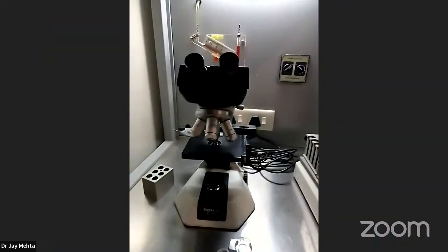So friends, actually, I am sitting inside my small IUI laboratory. And one of the most important words which you should keep in mind here is small. Even if you have a restriction for space, the laminar airflow which is going to suffice for an IUI laboratory will be either a 2 feet by 2 feet one or a 4 feet by 2 feet one. You don't need a laminar airflow higher than that. That is just one thing which you need to keep in mind. I will just try to switch the position and I will show you.